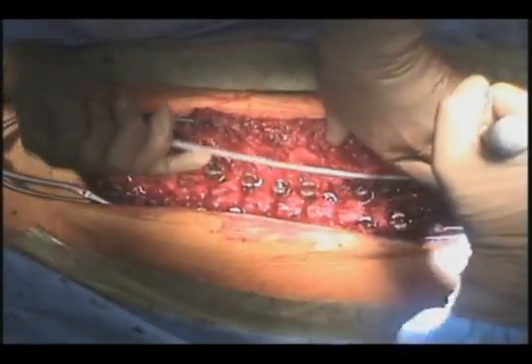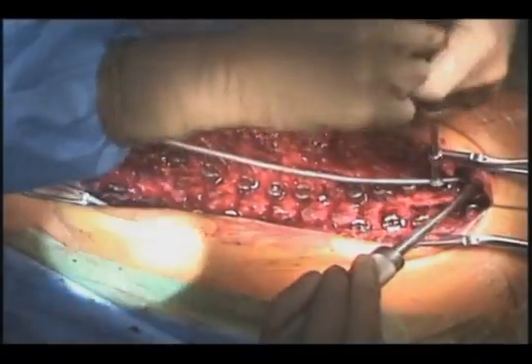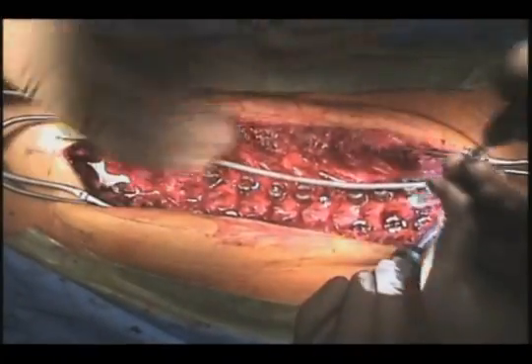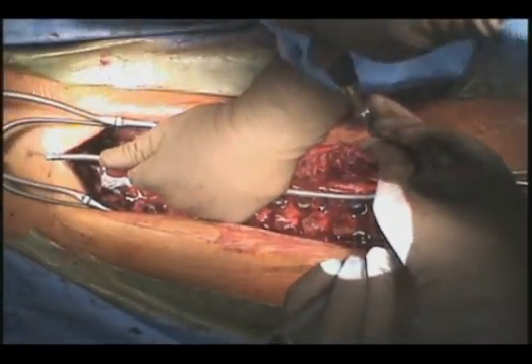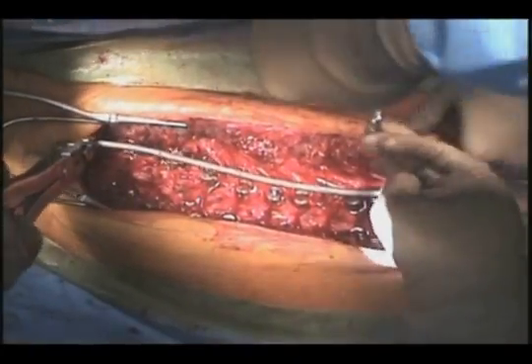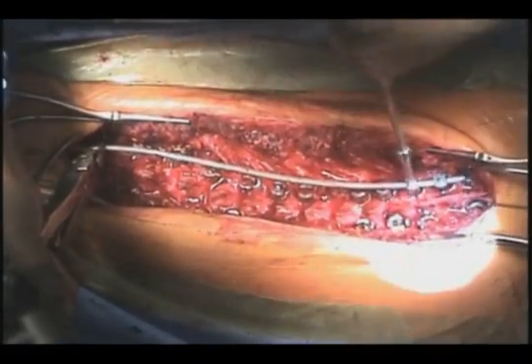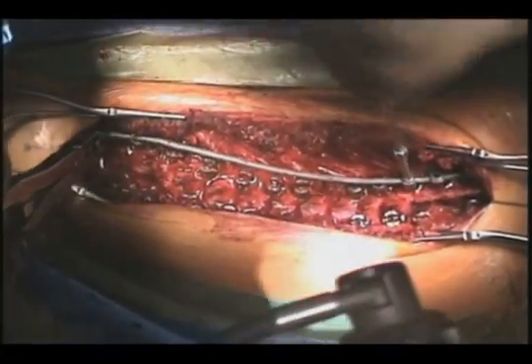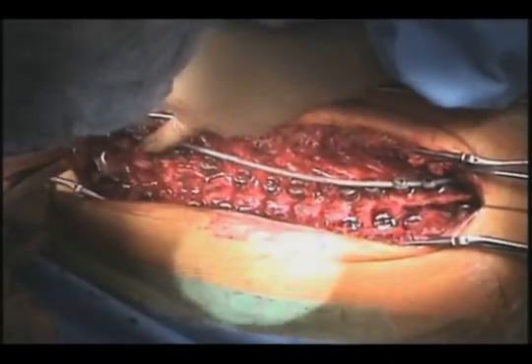Here we are seating the rod proximally in the cephalad screws, placing set screws in, and then after I've seated the rod in the proximal screws, I'm able to cantilever the rod distally into the lower screws of the construct. And we place the rod in the coronal plane, taking advantage of the sagittal bends to make it easier to insert.